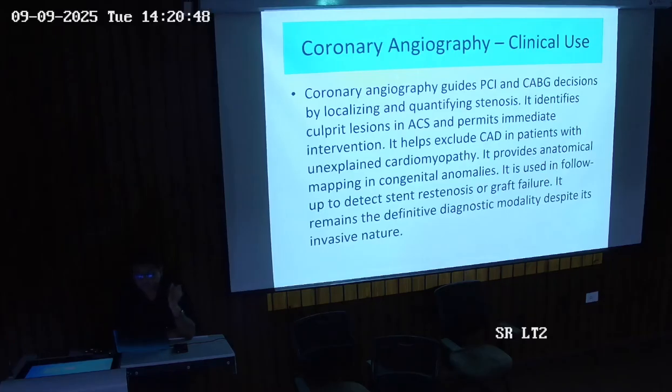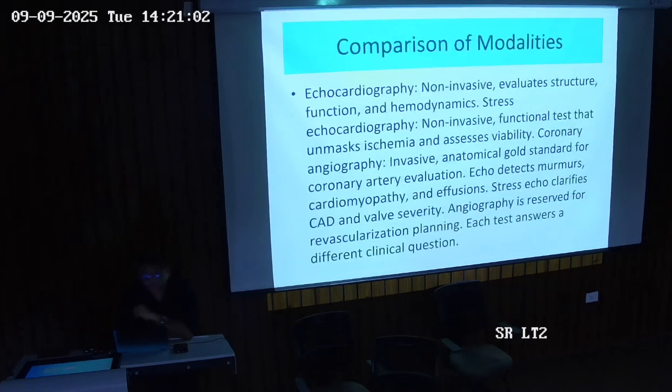It provides anatomical mapping and shows congenital anomalies also. It is used in follow-up patients to detect stenosis, graft failure or graft occlusion. It remains the definitive diagnostic and therapeutic modality despite its invasive nature. There is no direct comparison, but there are some points we can discuss in comparing the modalities.